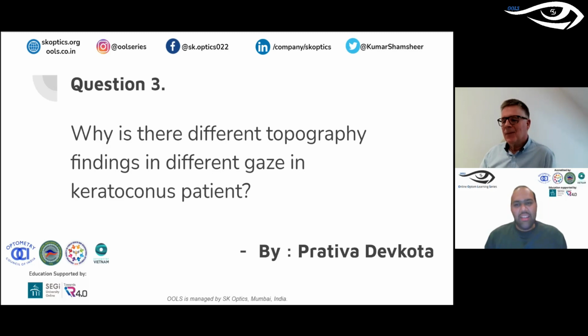Yeah, I think very well said. You should know what the instrument provides, and if that serves your purpose, right? If you are just into contact lens fittings, I guess the Placido-based topographers do wonderfully, because you just need to map the anterior curvature and you're going to put the contact lens on.